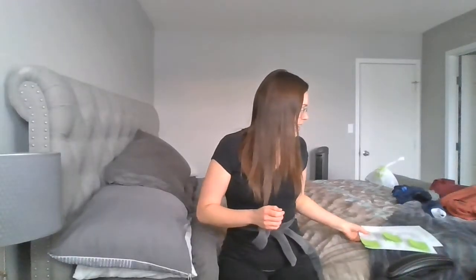So with a two-person, you would obviously put the transfer belt again around the waist for the patient, or on the nipple line, or underneath, wherever it works for you, but preferably the waist. You're going to instruct your patient well before you get started on the command words. We're going to go 1, 2, 3, command word. Okay.